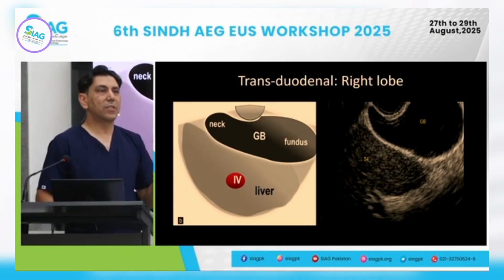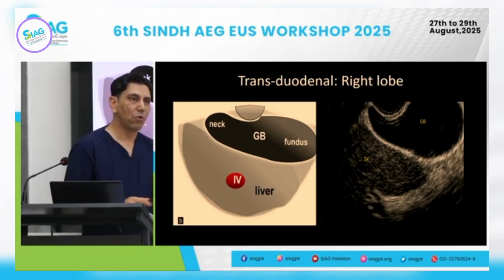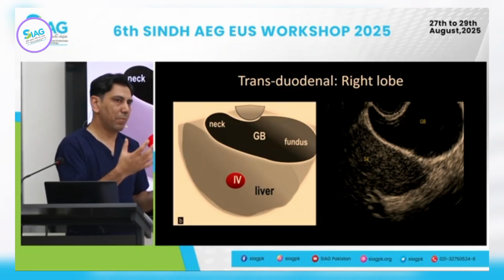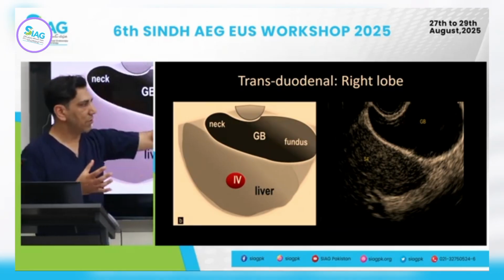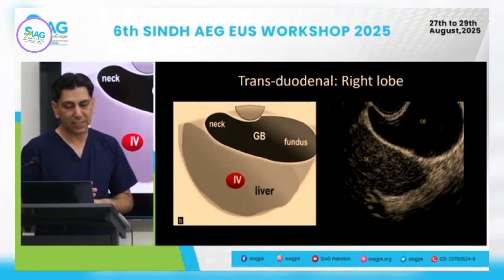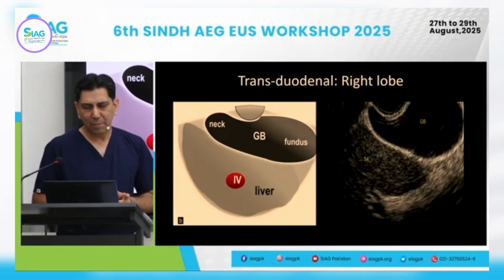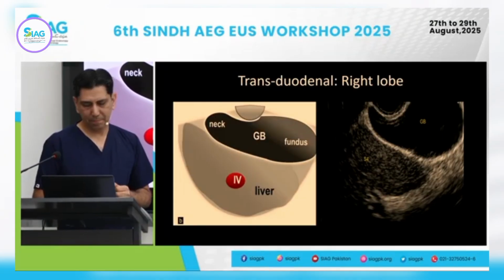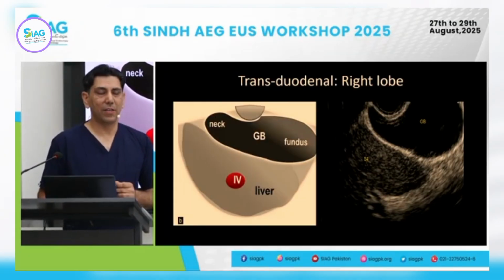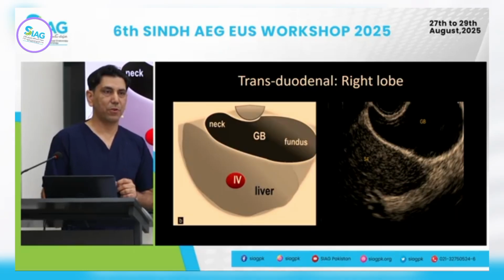We mentioned looking at structures, right lobe, and gallbladder. Most of the time, the segment associated with the gallbladder is segment 4, and the segment with the right kidney is segment 6. What is the clinical application of this? You commonly see focal fatty sparing reported on the ultrasound report.